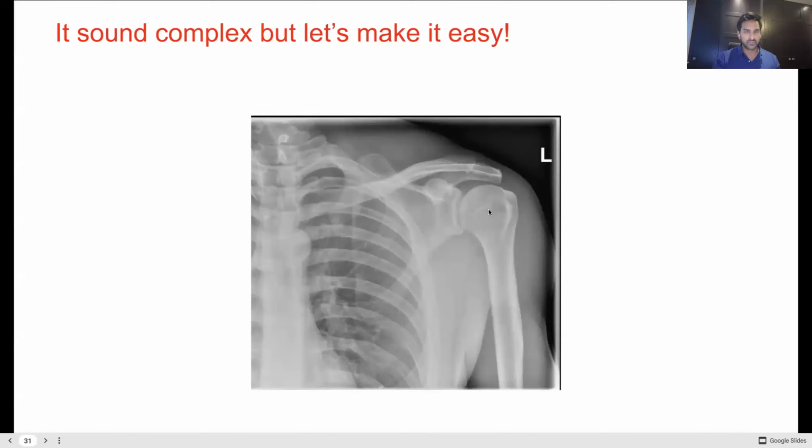So we're going to go through the anatomy on this X-ray, and then that will make things slightly easier when we go through some of the cross-section imaging. And by cross-section imaging, I mean the MRI scan. So this little thing sitting over here is the coracoid process. If you know nothing else, this is the most anterior aspect of the shoulder. This is the thing that points forwards.